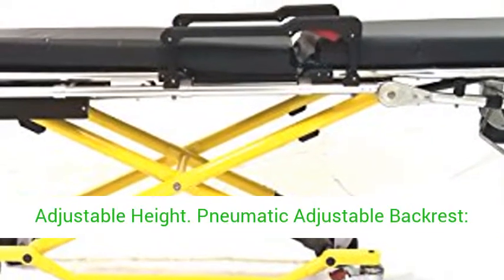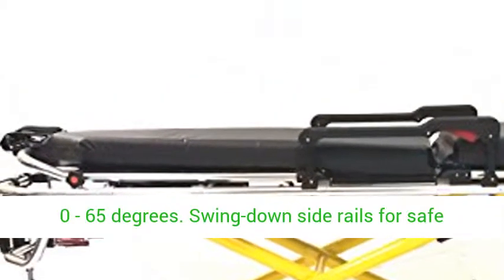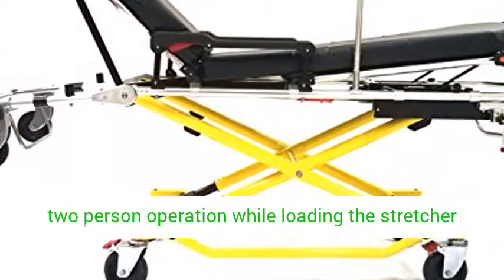Adjustable height. Pneumatic adjustable backrest, 0 to 65 degrees. Swing down side rails for safe patient transport. Breakaway head section. One or two-person operation while loading the stretcher onto the ambulance.